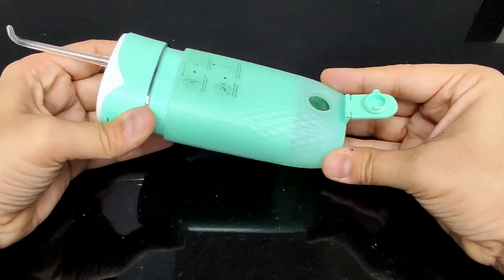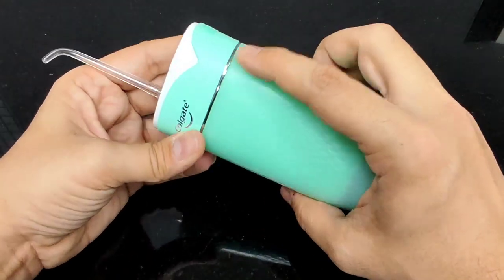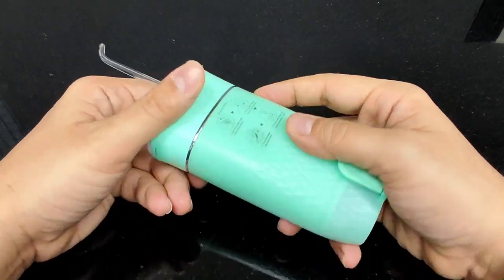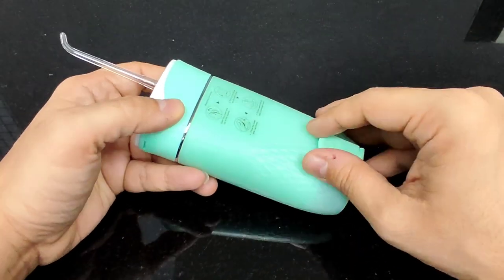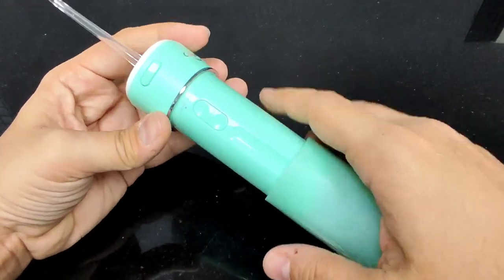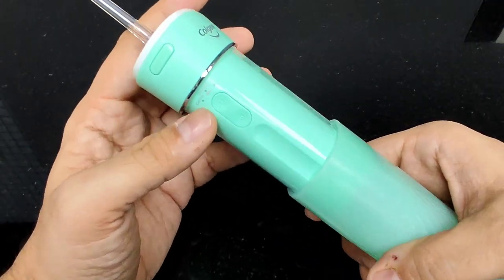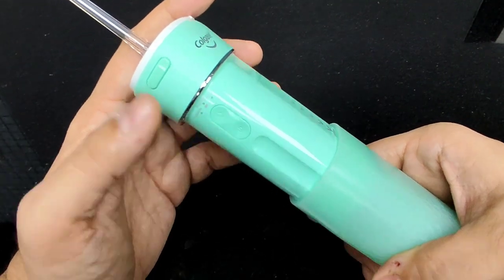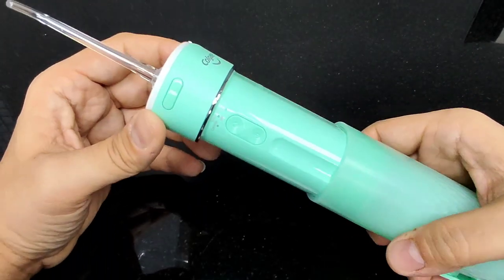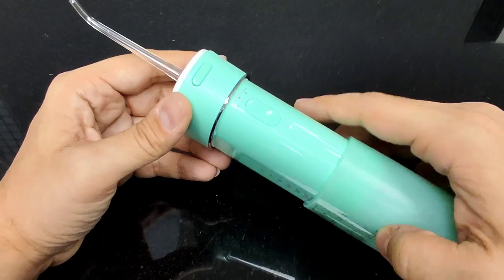Another very smart thing Colgate has done: there are no buttons on the outside of the body, so you can't accidentally switch the device on or off. Only when you open and slide it down does the power button and mode button become accessible. The mode button offers three settings — gentle, regular, and pulse — so you can choose the pressure and pace that suits you.